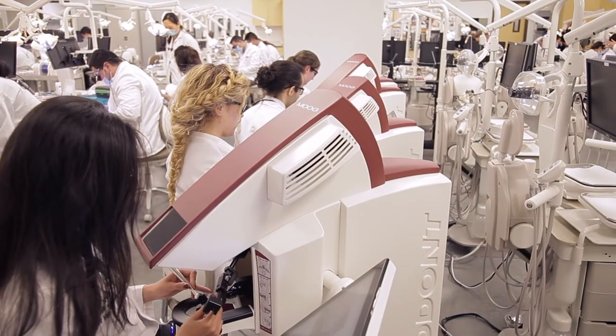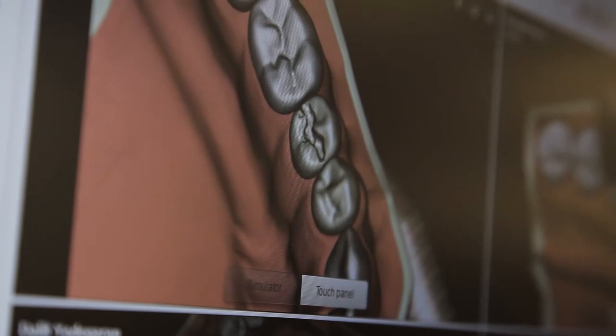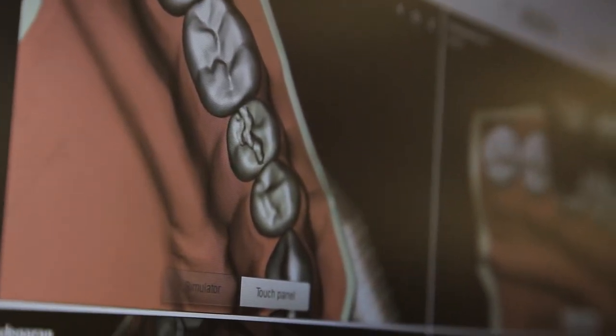When I actually had the chance to sit down on that, I was like, wow, this is amazing. It is so real. The feedback, the way it shows you the tooth, the design — you end up becoming more proficient faster.